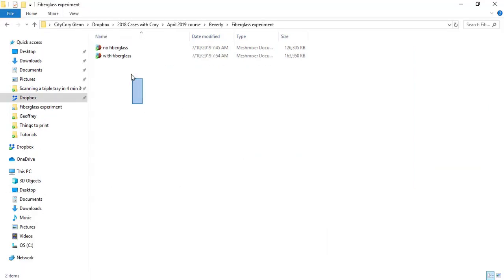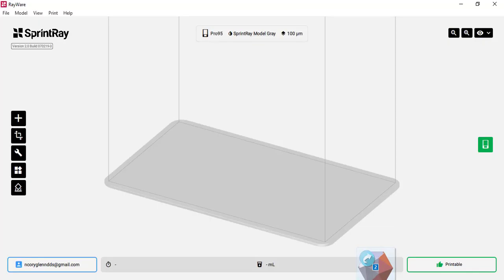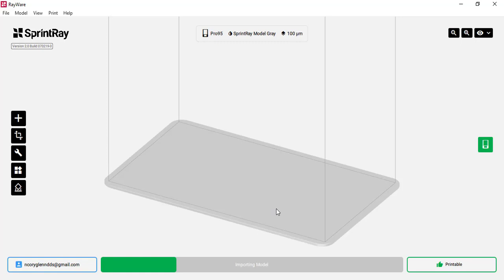I'm going to take one without the channels for fiberglass and then also the one with the channels, and print both of these on the Sprint Ray Pro. I'm just using gray resin and I'm going to do a hybrid with both and then just do a strength test. I'm going to try to crush it in my hand.